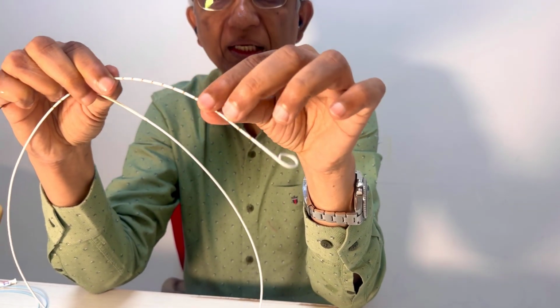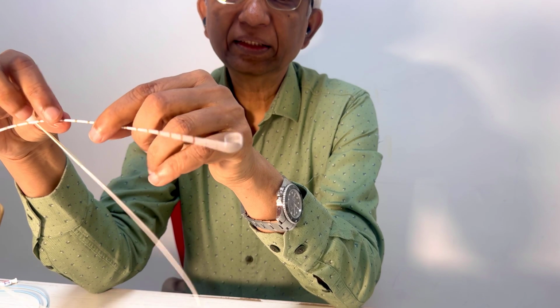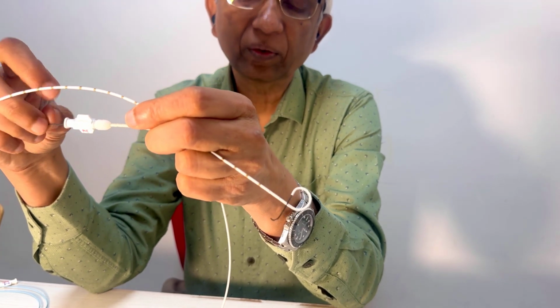Okay, it will go straight down the ascending aorta. Now you want to make it go into the descending aorta. So pull this back so that it's at the origin of the innominate artery. Now see what happens. Just imagine you're right here, just at the origin.